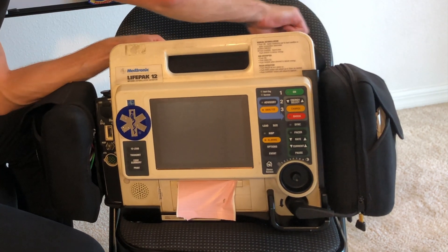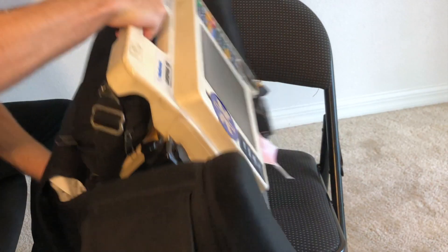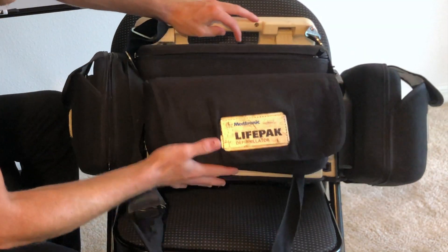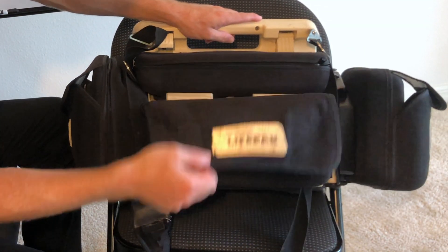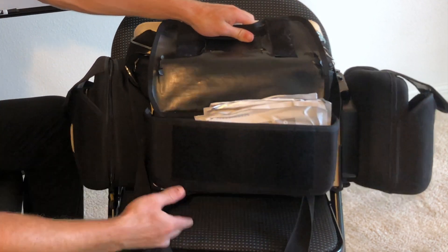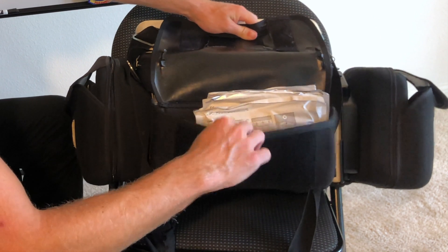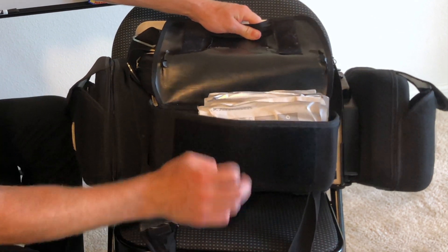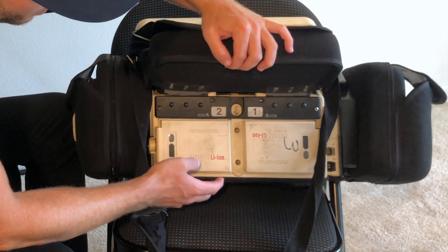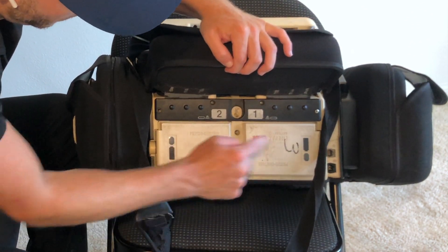Then finally I'll show you the back. So the back has a pouch — this opens up. Here I keep all spare electrodes. Some people will keep other blood pressure cuffs back here as well, a spare battery, stuff like that. And then finally back here you have the actual batteries for the LifePack.